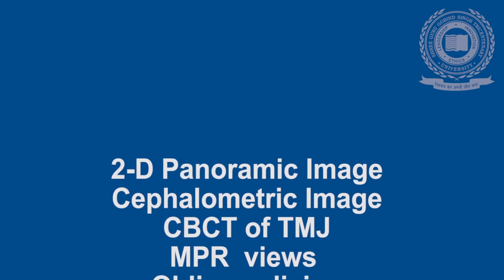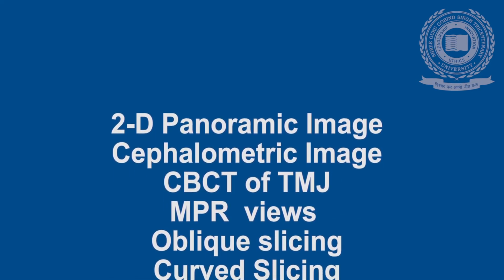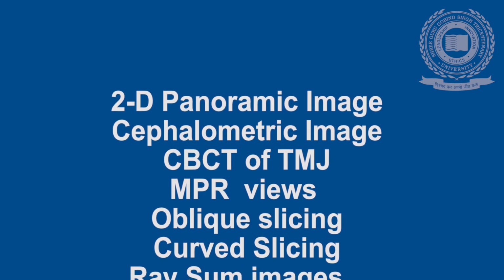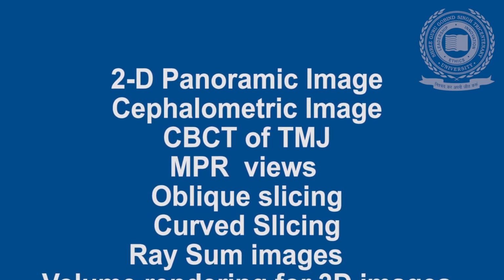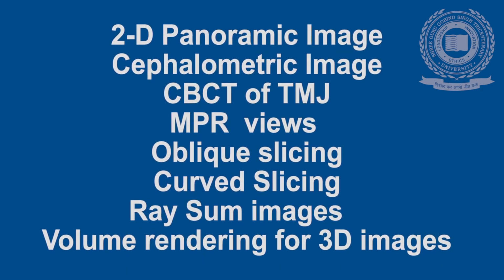The possible image visualizations in CBCT are 2D panoramic image, cephalometric image, CBCT for TMJ, MPR views, oblique slicing, curved slicing, ray-sum images such as panoramic or cephalometric images, and volume rendering for 3D images.